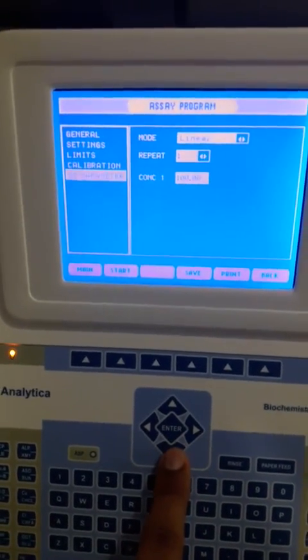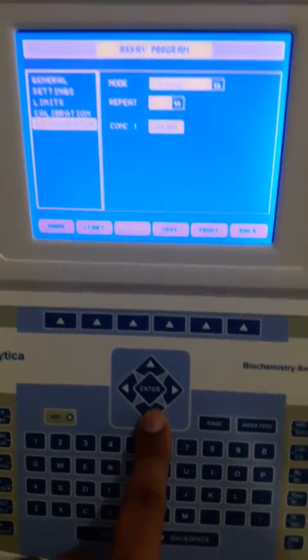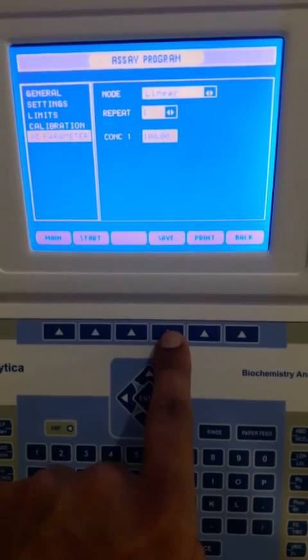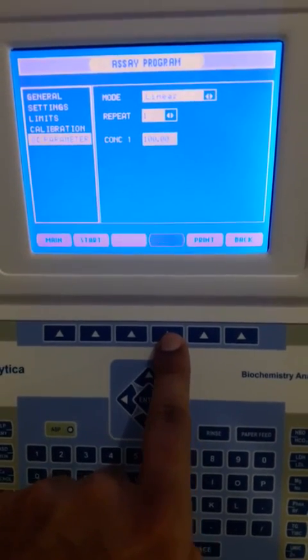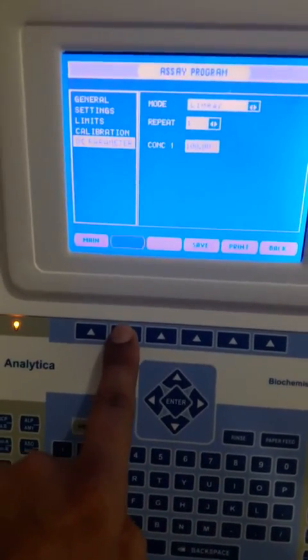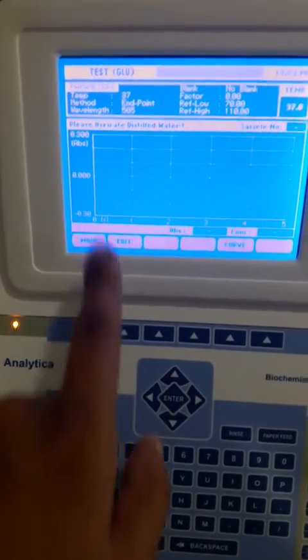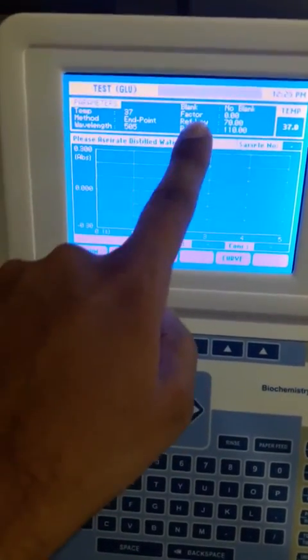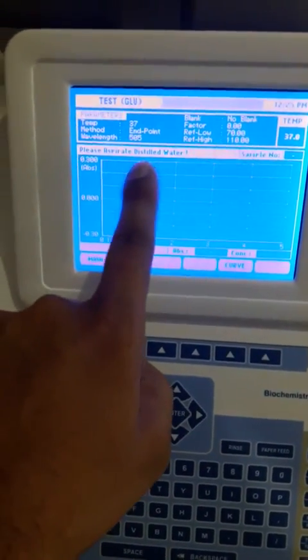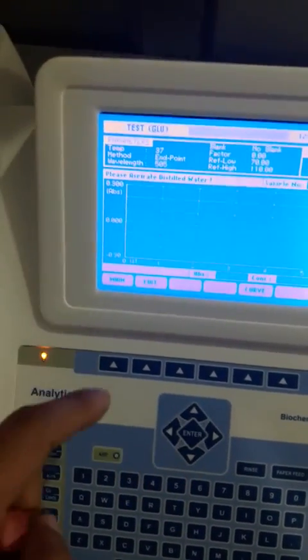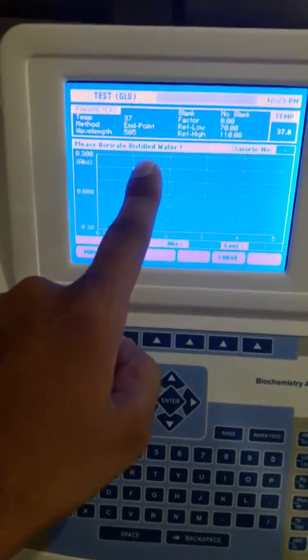After entering all these parameters we have to press Save. We have saved the values of the parameters. Now we will go to Start. After setting the wavelength and temperature, this screen will demand to aspirate distilled water, so now we will aspirate the distilled water.